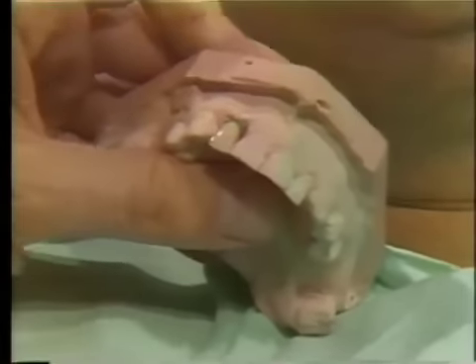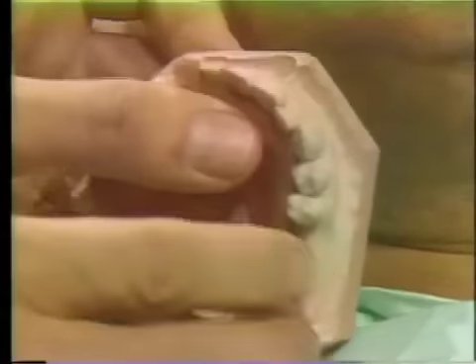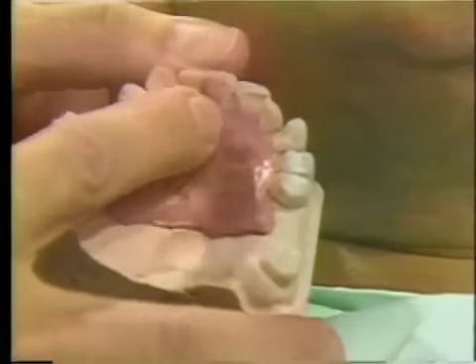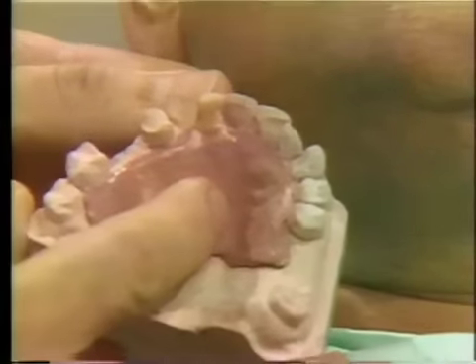At the last visit, you may remember, we took impressions to make study casts for this bridge case, and we also took a shade. In the meantime, those impressions have been poured, and we have our study cast now. The shade which we selected last time was used to select a facing of the correct mold, and that has been ground to fit the mucosal area of the study cast and has been mounted onto this gutta percha base plate here, so that we can try this in the mouth today, and our patient can have a look at it and see how the finished bridge is going to appear.